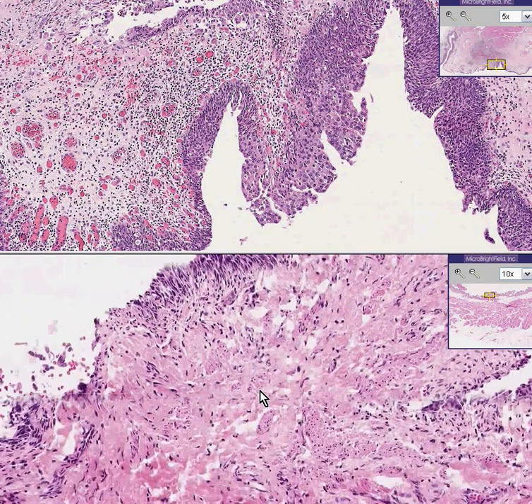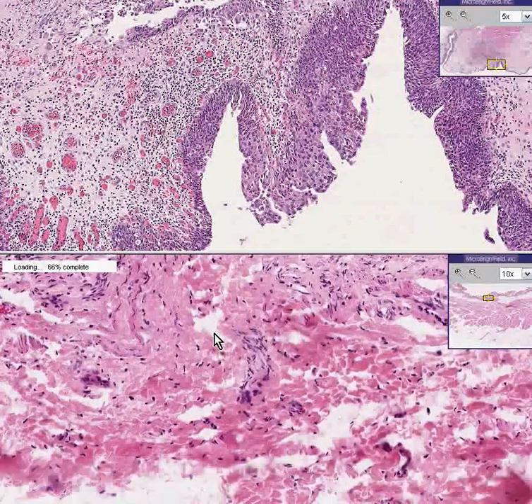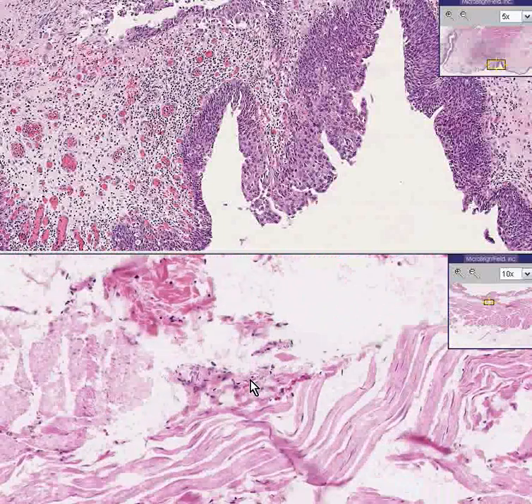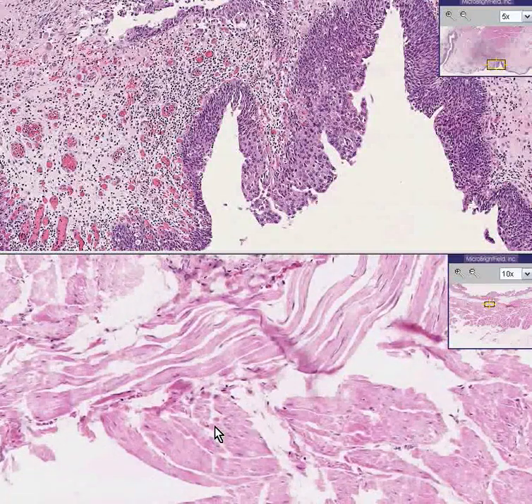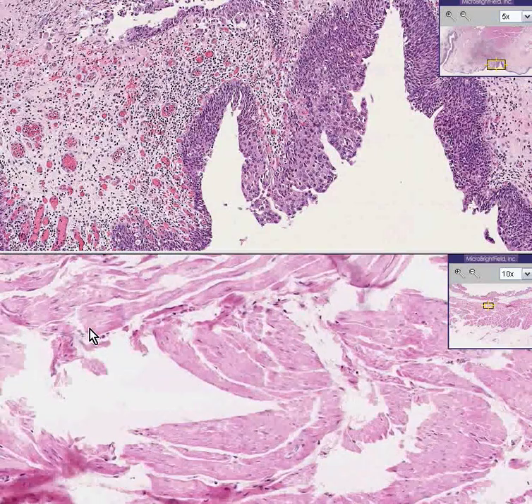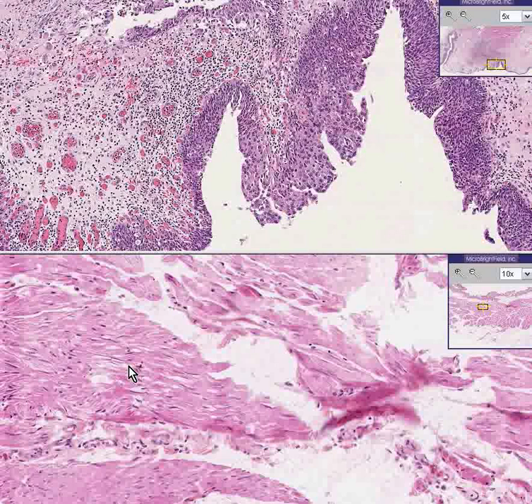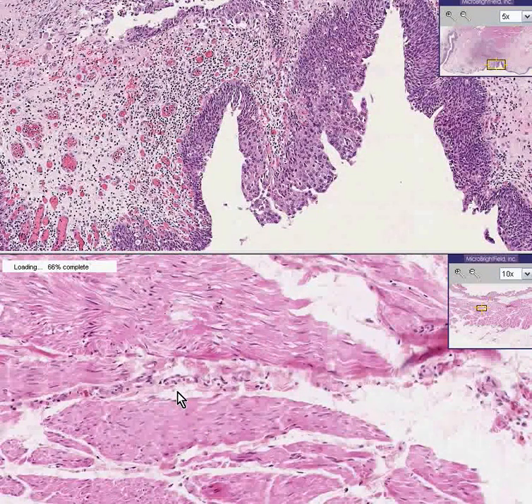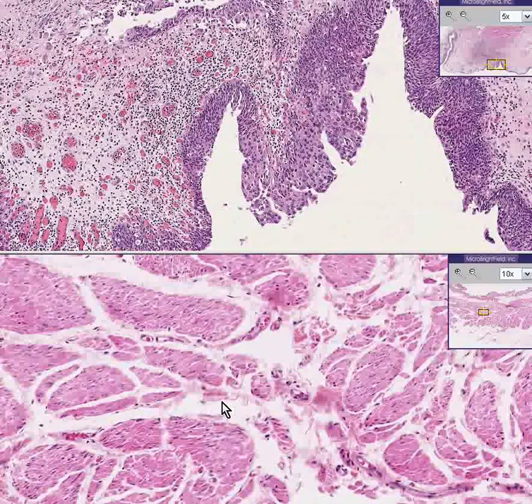It changes. Notice we have a lot of nice loose connective tissue under the epithelium. Also notice that the majority, perhaps 90-something percent of the weight of the bladder, of the tissue of the bladder, is smooth muscle going in whatever direction it has to go to make that detrusor muscle contract nicely to allow for micturition.